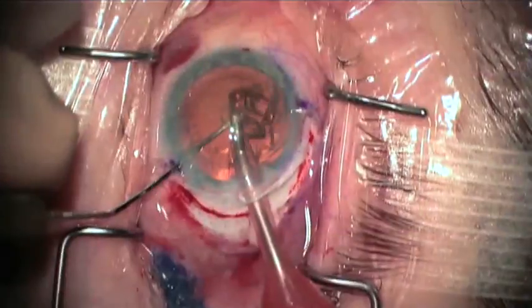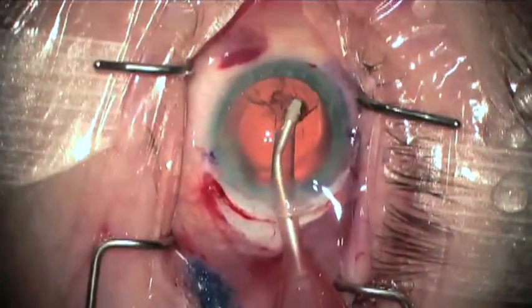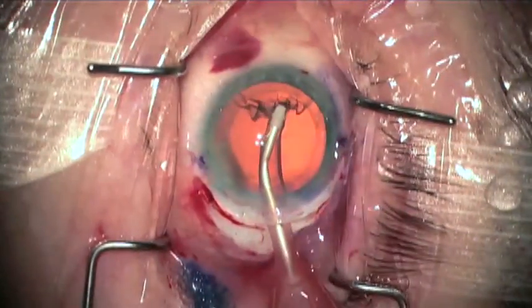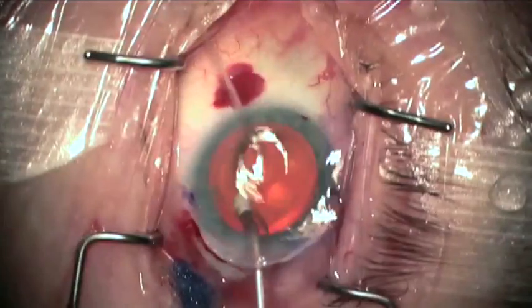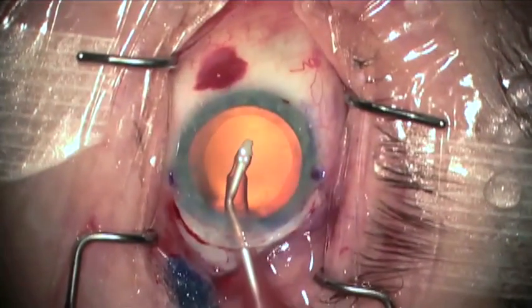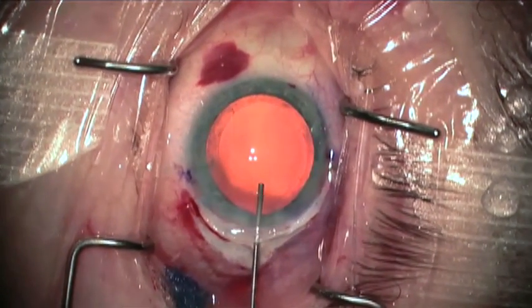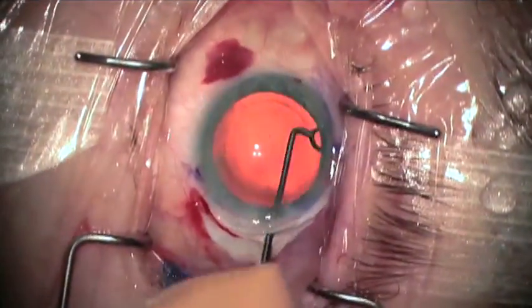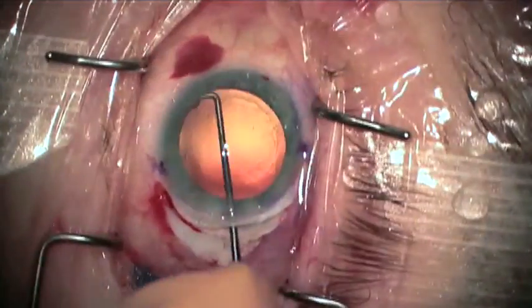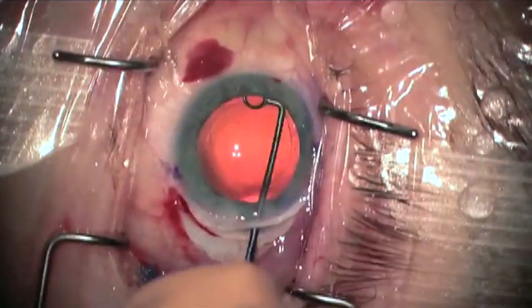The cortex is also fully removed with the IA system, and the posterior capsule can be polished at the discretion of the surgeon. It is my preference to also polish the anterior subcapsular LECs to reduce the tendency for postoperative capsule fibrosis and phimosis.